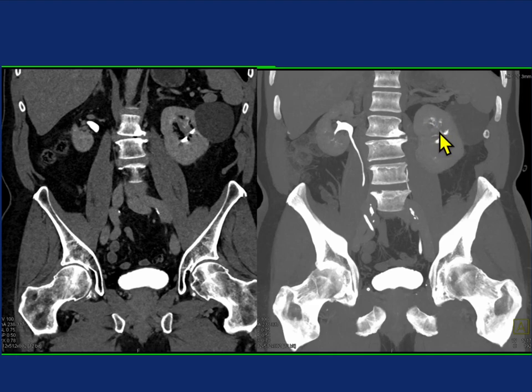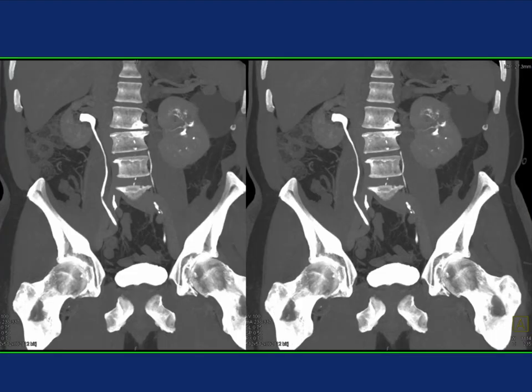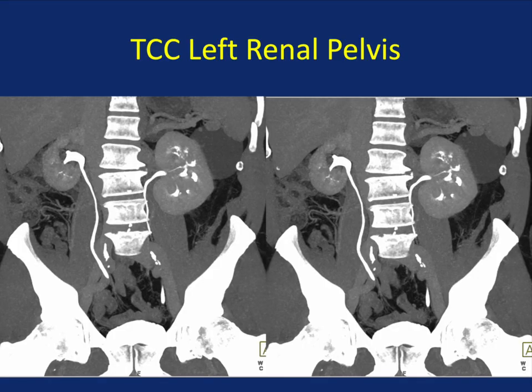There's a destruction of the mid pole calyx and the upper pole calyx. It's interesting how obvious the destruction is when you're looking at the MIP images. Even if you're looking at the coronal excretory phase, it's a bit less obvious. It's important to routinely look at the MIP to look at the calyces. MIP imaging is particularly valuable in looking at the ureter, the bladder, and calyceal destruction. Here's another patient with TCC of the left kidney, upper and lower pole — you would even worry about something on the right kidney as well.